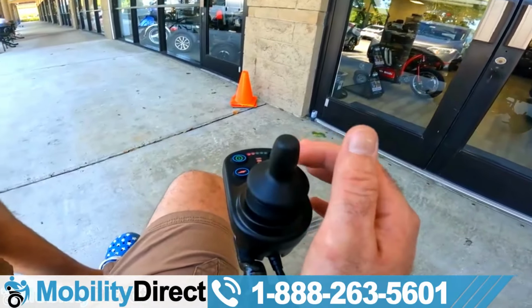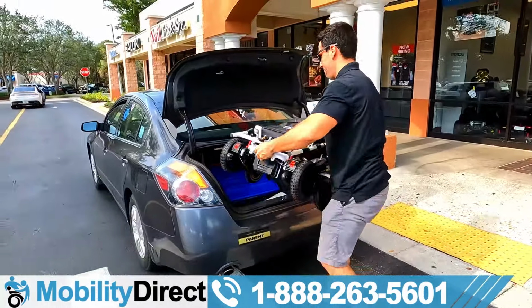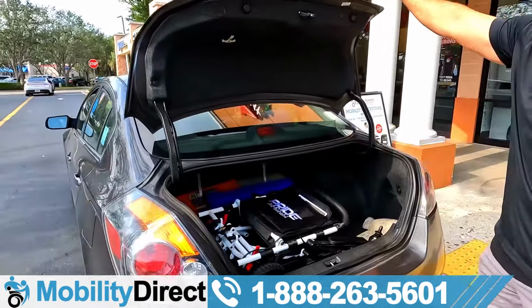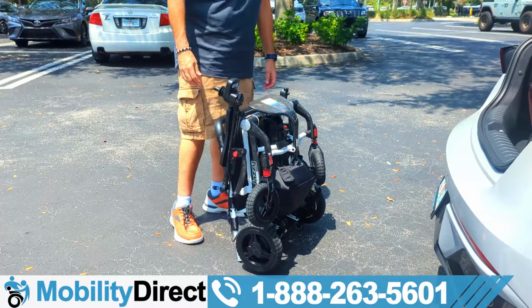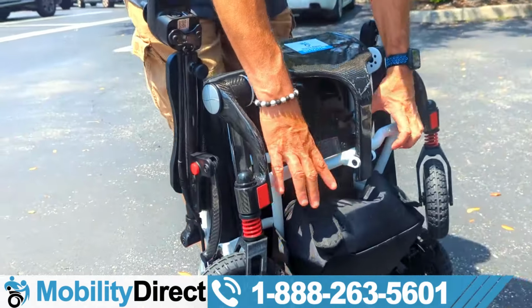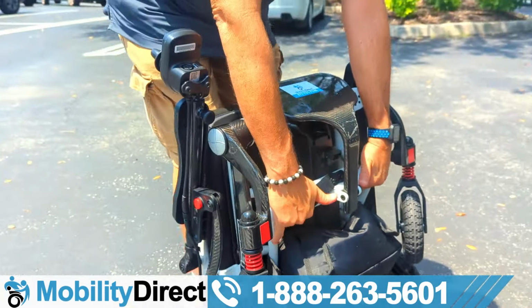Alright folks, so welcome to the end of the video, and I know what a lot of you are probably thinking. 43.6 pounds? That's heavy. This young man in the video could surely do it, but what about me? I can't lift that much, and you're right. So here's that secret tip I was going to tell you about, and it has to do with the way you can use leverage to pick it up. There's some handles on each side of the foot platform that we're pointing out here.